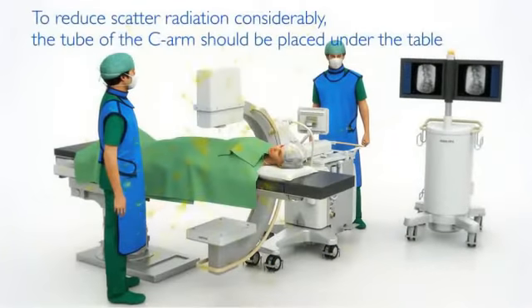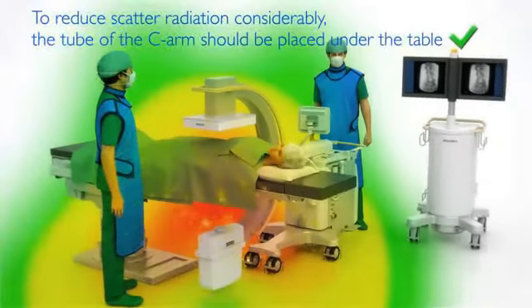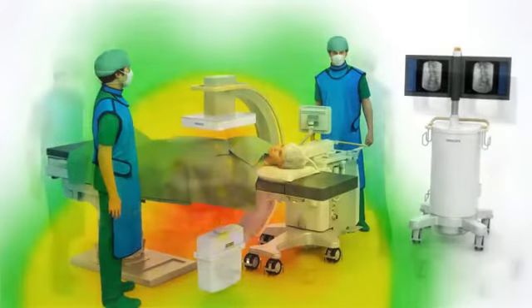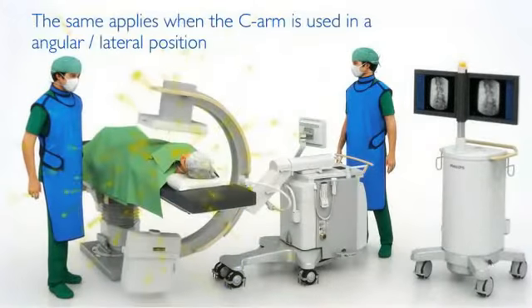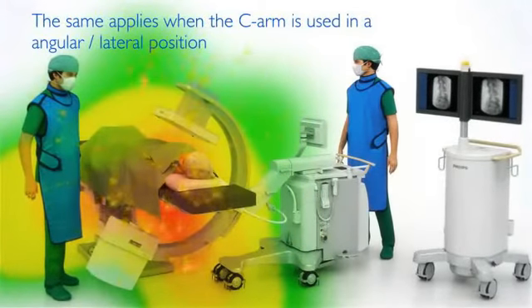When the tube of the C-arm is placed under the table and the staff is facing it, the dose received of scattered radiation is reduced considerably. The same applies when the C-arm is used in an angular or lateral position.